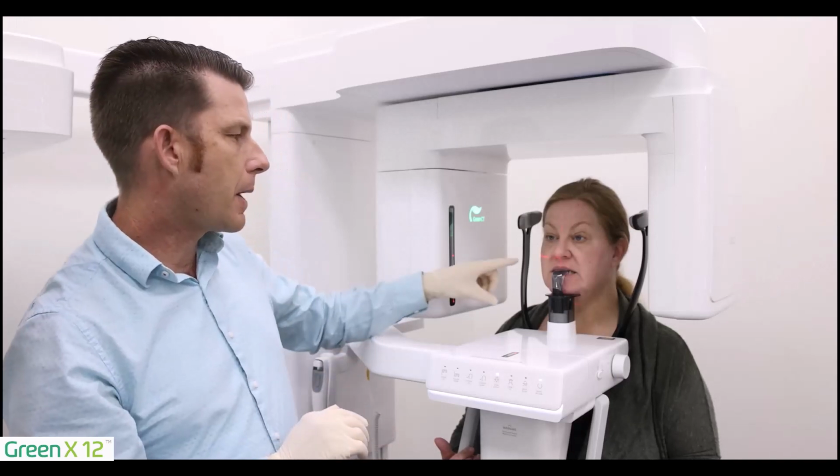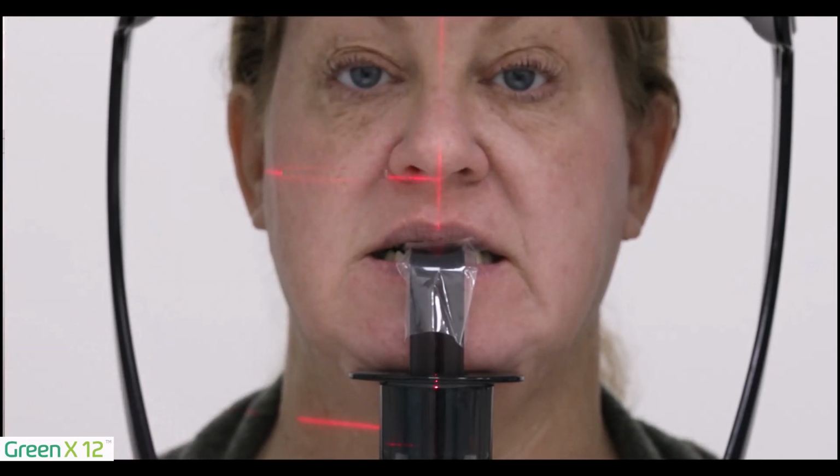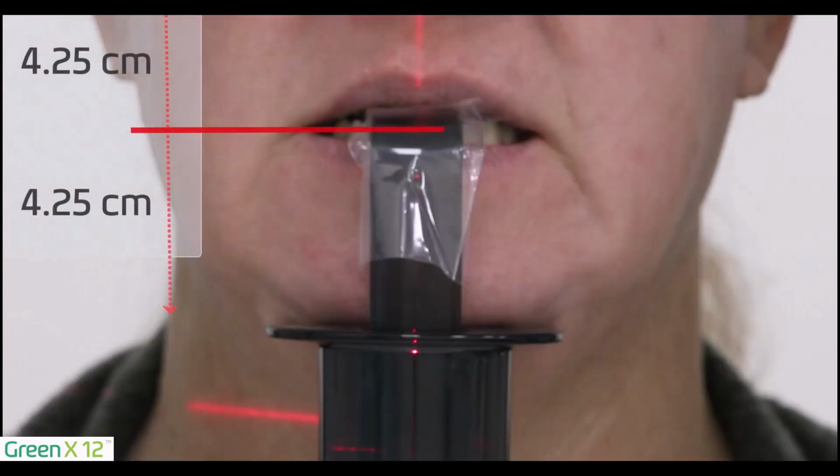The important thing to remember is that the horizontal beam is the center of the height. When capturing the 12 by 8.5 field of view with a height of 8.5 centimeters, the horizontal red beam will be positioned to display at the center of the 8.5 centimeter in height. This positioning aims to project the beam approximately at the patient's occlusion.